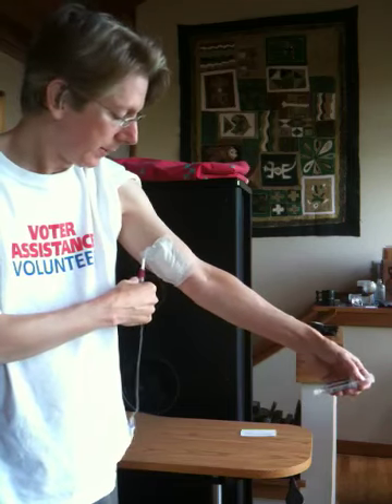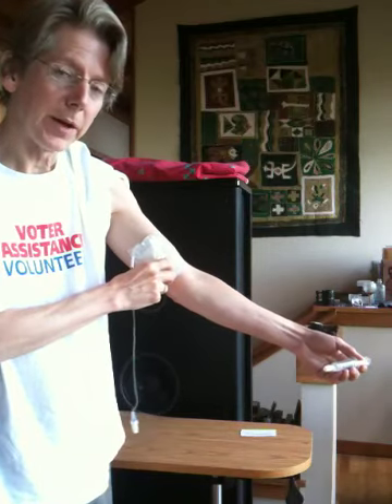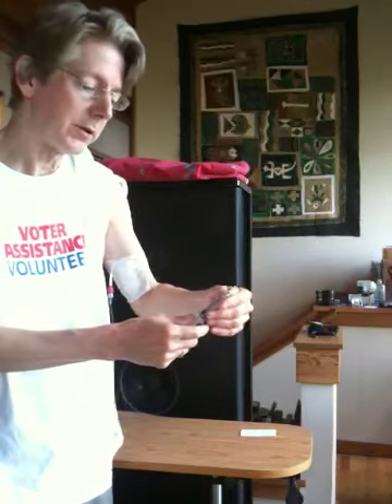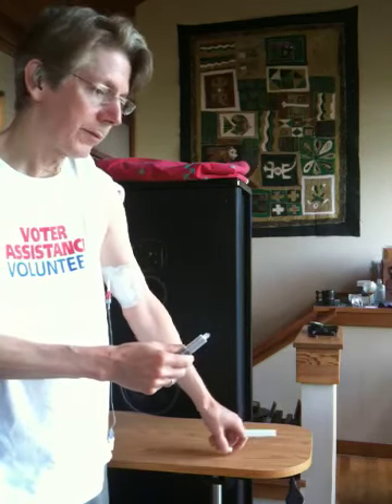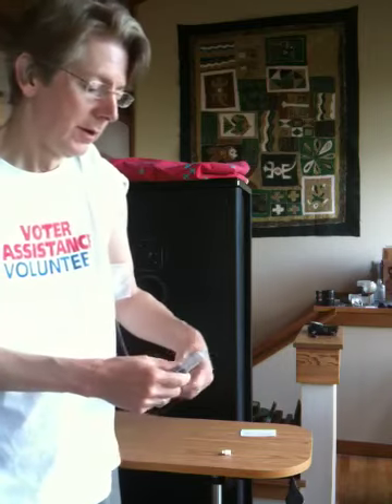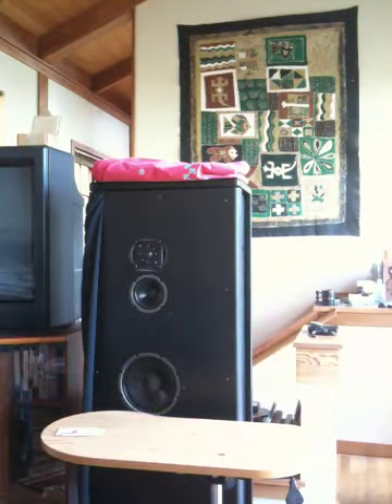My skin has gotten all messed up and it's been difficult to keep the line in. We've tried all kinds of different patches. Every day I have to flush the line to keep it from clotting, so that fibrin — little fibroid tissue — doesn't grow.